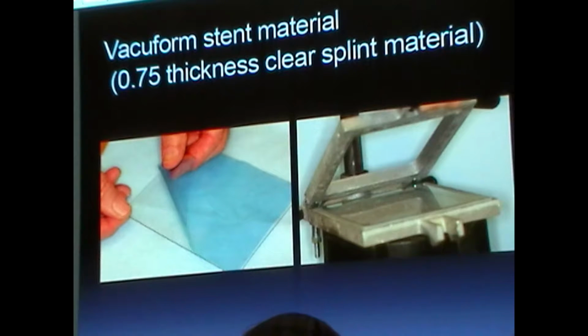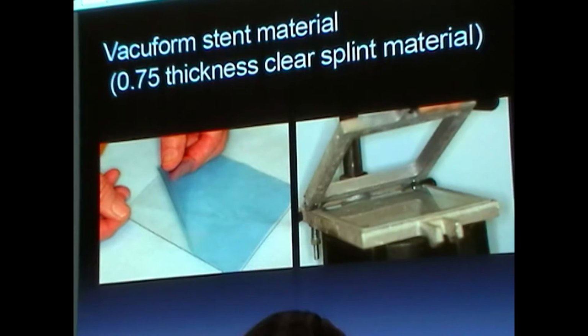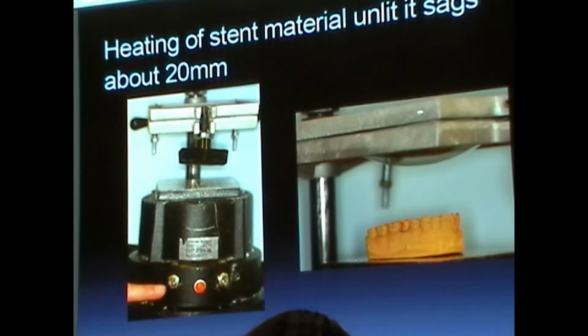Oh, it is important, notice that once we distribute the material to you, it does have plastic coating on both sides. That is to make sure that dust does not get on the material and set a fire once you're going to heat the material up. But you also want to make sure you remove the blue protective plate before you insert it into the machine, okay? It will melt, it will catch fire, so please don't do that. Or be careful not to do it.